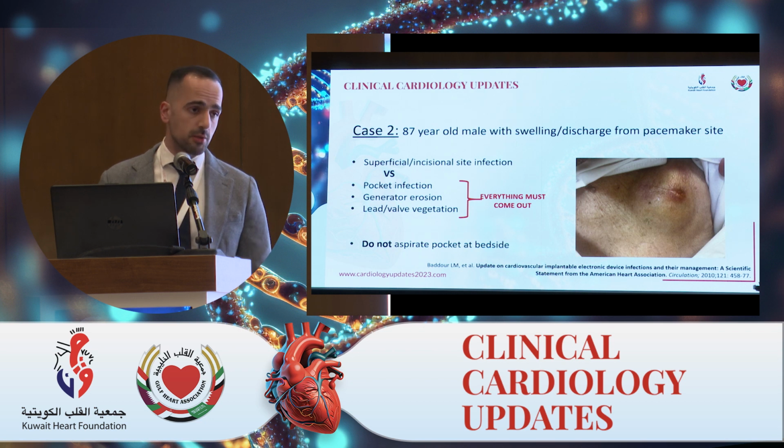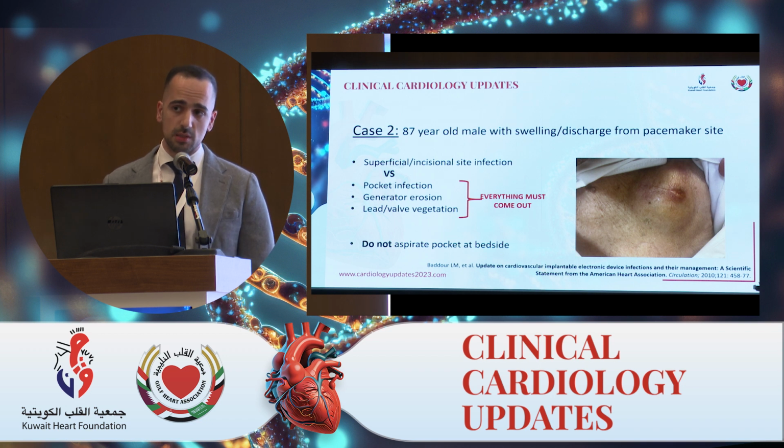Another common scenario is a patient who just got a device or got a device a couple of years ago and reports swelling or discharge from the generator site. One of our biggest concerns is device infection, and the reason is if any part of the CIED is infected, it can track all the way into the heart, lead to vegetations, endocarditis, and in that situation, everything needs to come out.